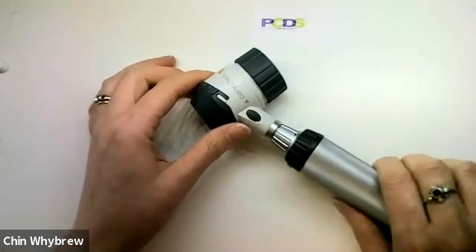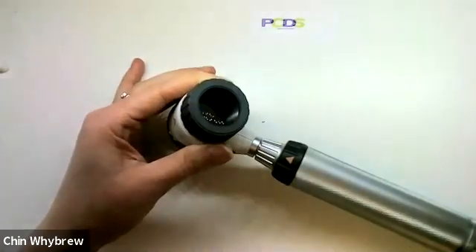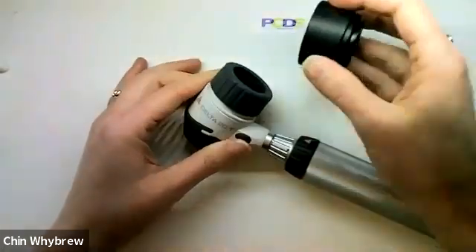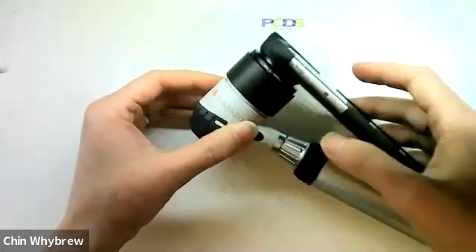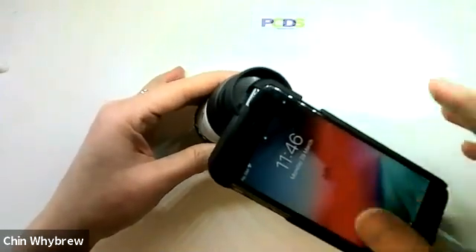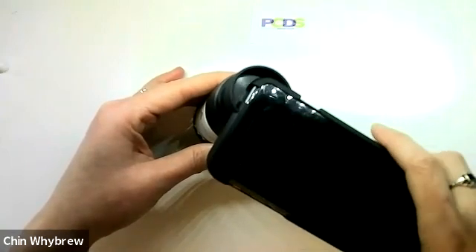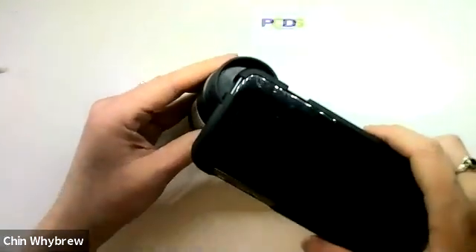In order to attach a camera to it, there are a few things to say. Firstly, this is not magnetic, so you can't attach your standard magnetic adapter to it. You need a piece of equipment like this that attaches onto the magnetic adapter and then sits on top of it. It's not held in place particularly firmly, so you do need to make sure you are supporting your phone and your dermatoscope, which can still be done with one hand perfectly easily.